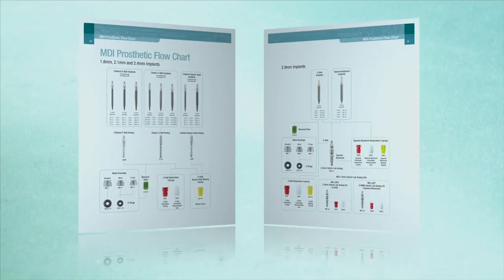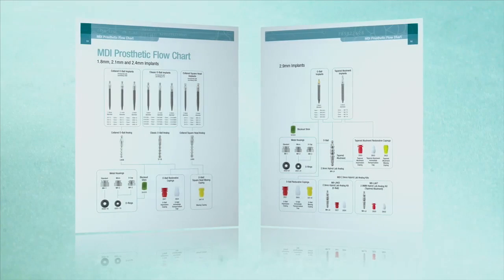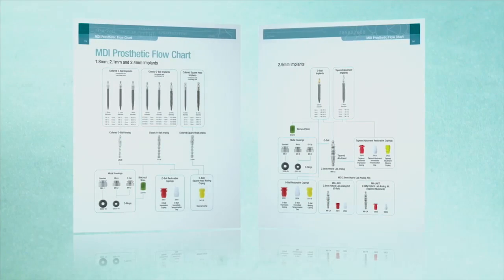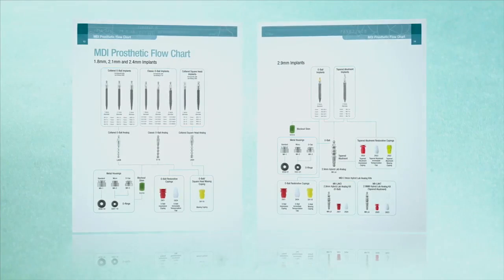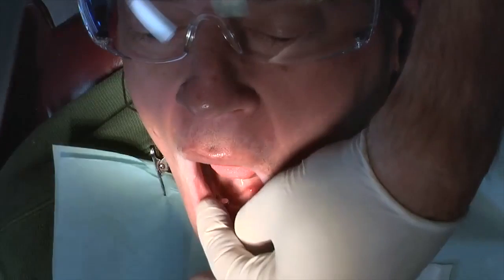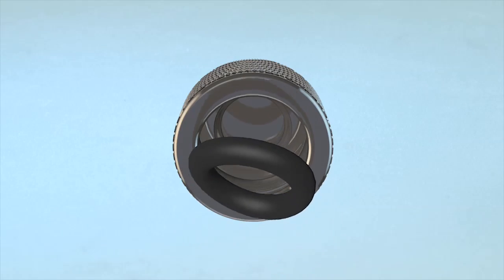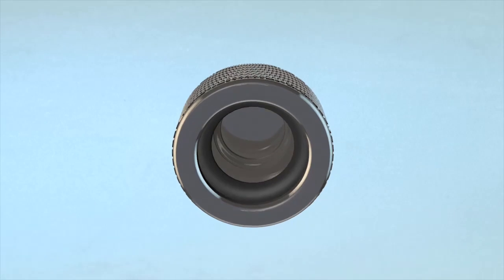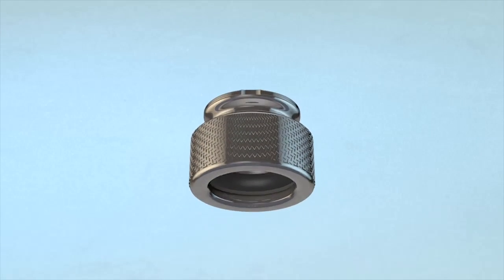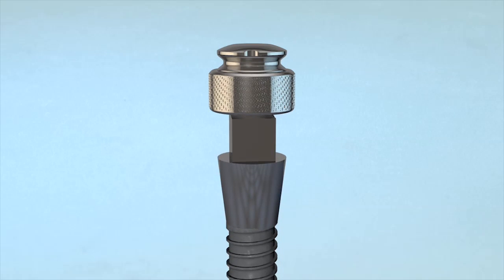In cases when new dentures are being fabricated, 3M ESPE offers implant analogs and impression copings for accurate housing positioning. Place a housing on each implant abutment to check position with a passive fit. The housings have a replaceable O-ring that provides compression fitting to the O-ball abutment. The design of the housing and O-ring allows for minor vertical movement of the housing on the implant.